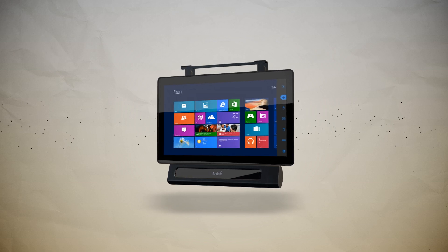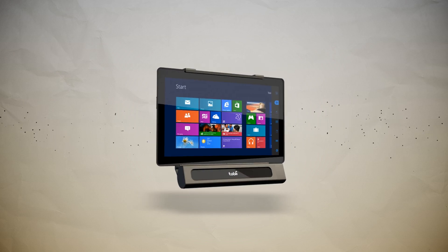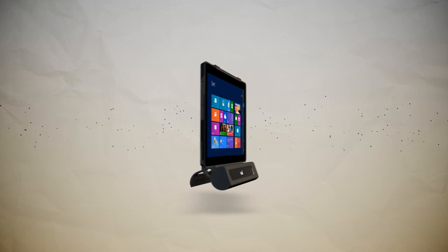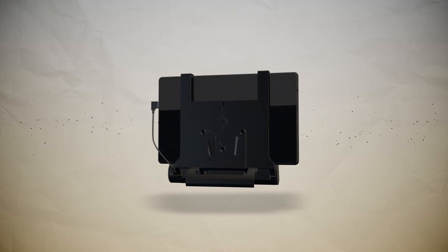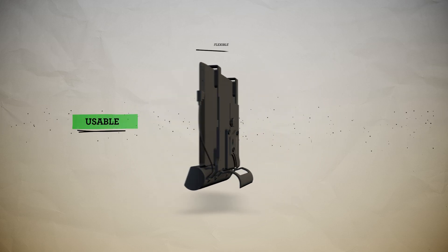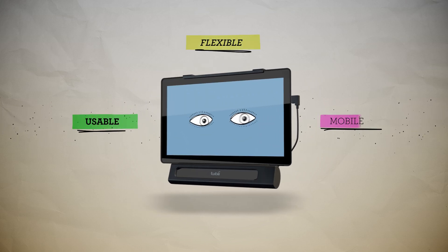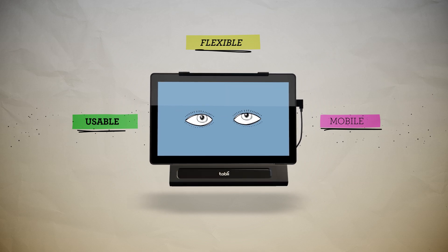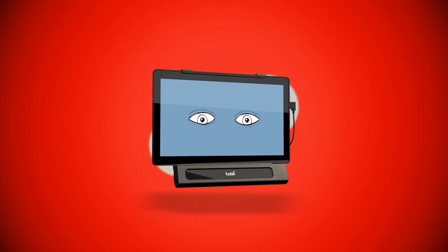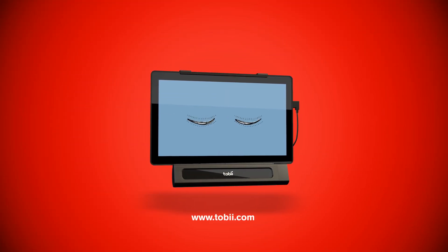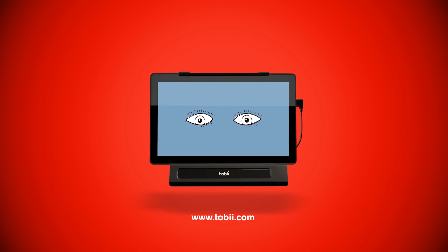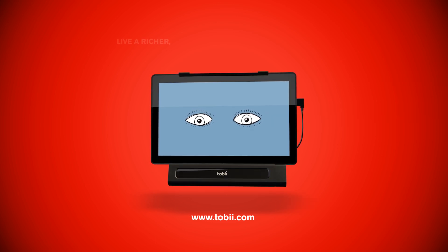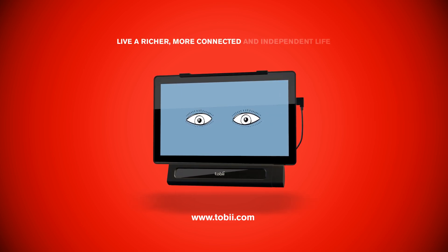The Tobii iMobile gives you hands-free access to all the functions of your tablet, making it a truly usable, flexible, and mobile solution for computer access. The Tobii iMobile empowers users and gives them the opportunity to live richer, more connected, and independent lives.